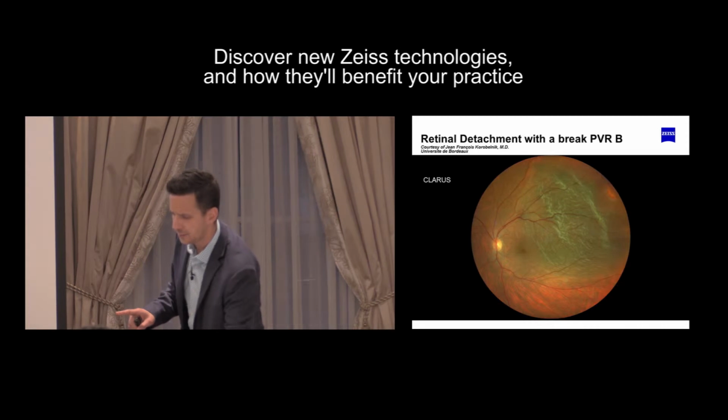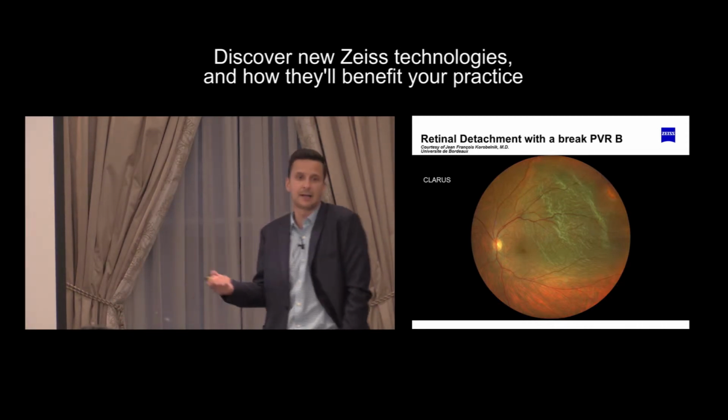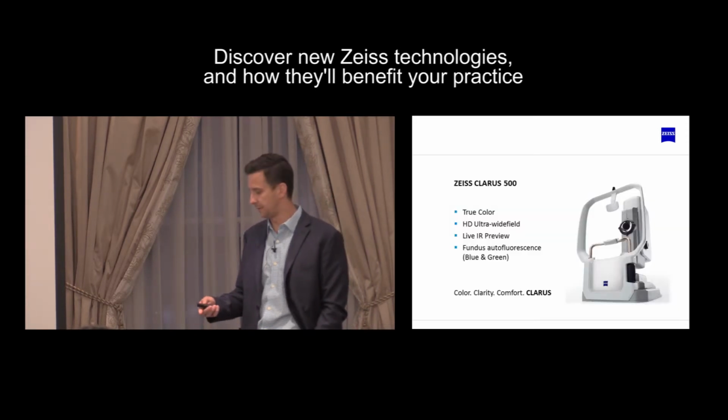I think it was our 2nd patient that we had. We actually picked up a retinal break that was out in the periphery in an asymptomatic patient while we were doing testing and going through the initial FDA clinical trial.